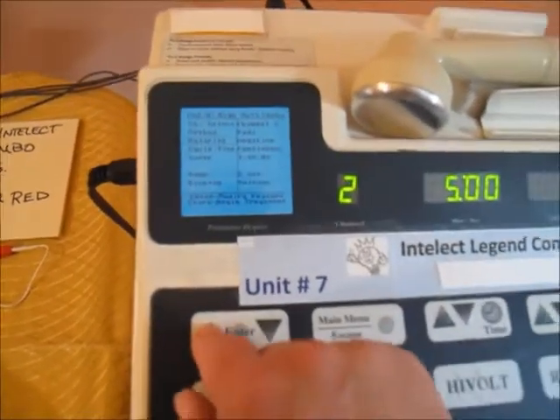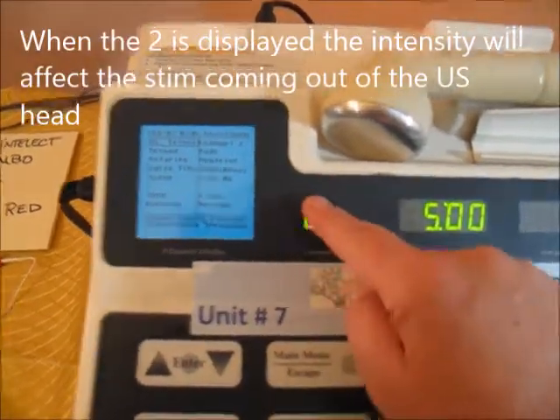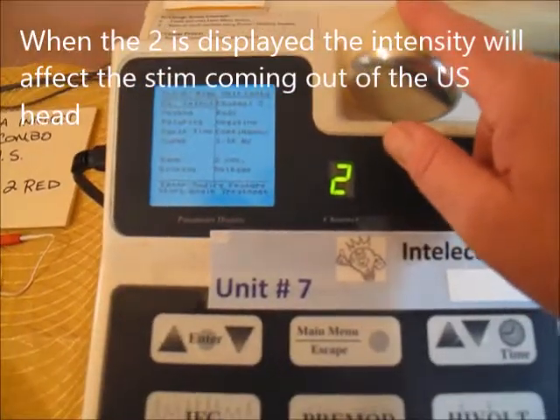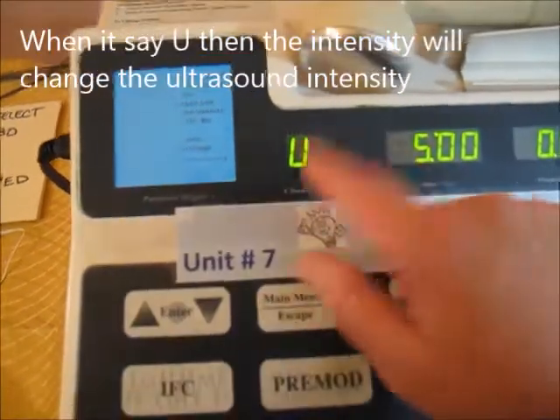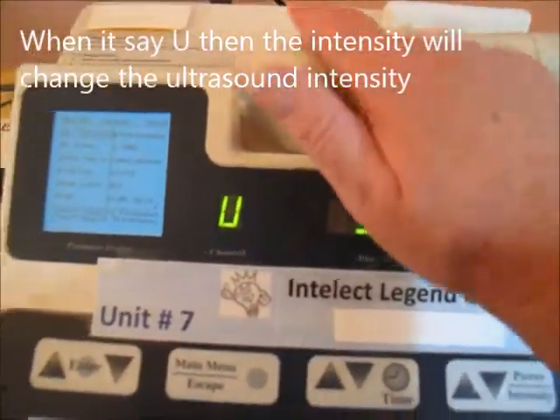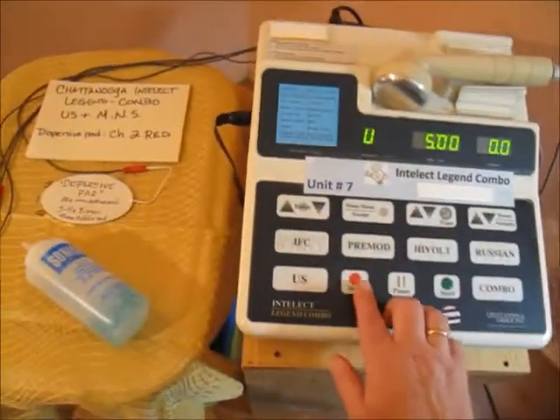When you want to work on ultrasound, go back to channel select. When it shows channel 2, the intensity affects the motor nerve stim coming out of the pad. When it shows U, the intensity affects the ultrasound output — the heat or pulsed sound from the ultrasound head. That should be a good overview.